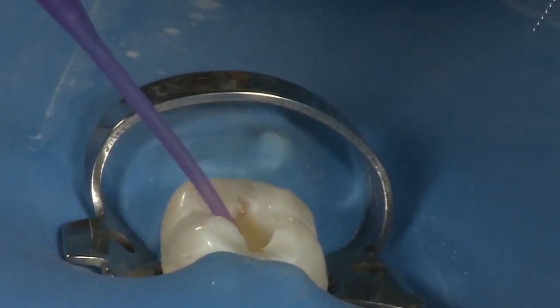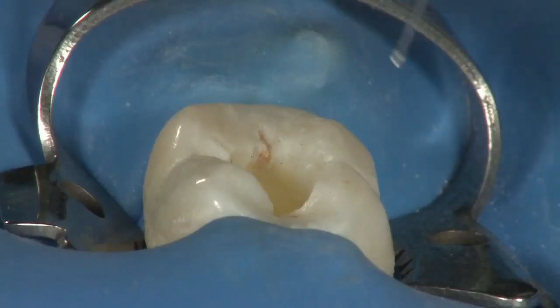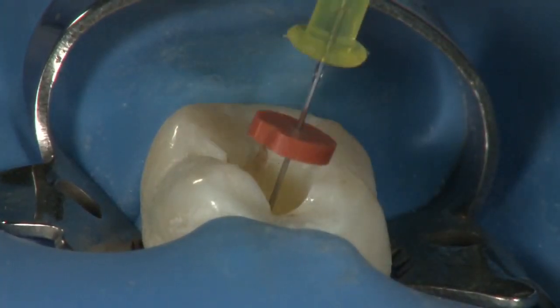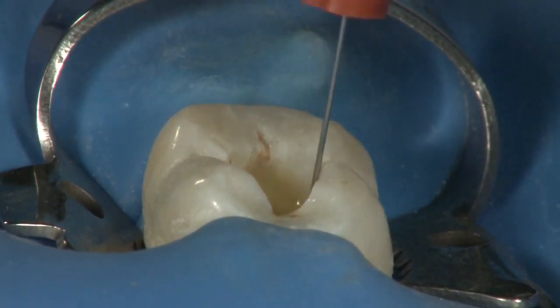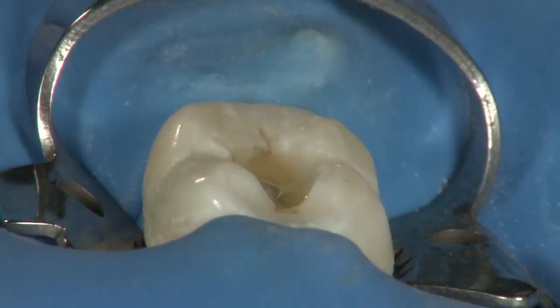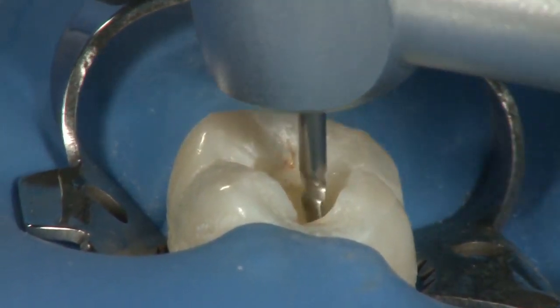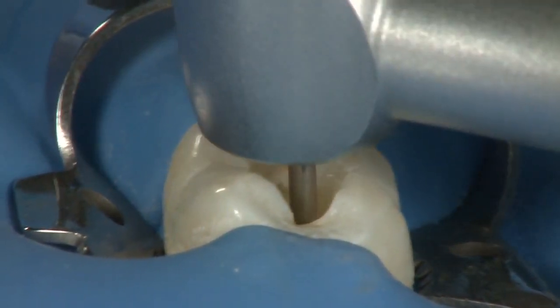Evacuate the canal and fill it with fresh Chloracid. Constant exchange of the irrigants will help remove dentinal mud and other debris from the canal. Repeated doses of Chloracid will help to break down all organic matter within the canal. Use a gentle, pecking crown down motion to gradually transition the file through the apical third.